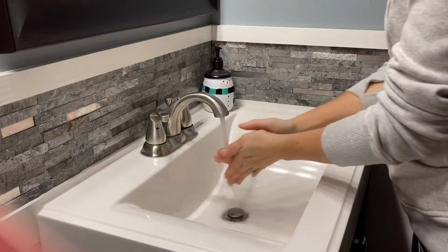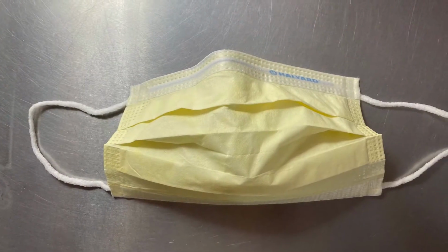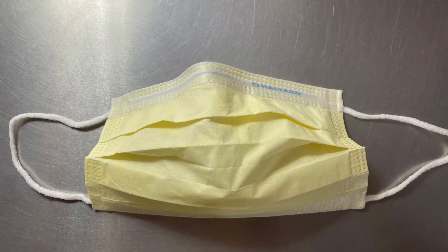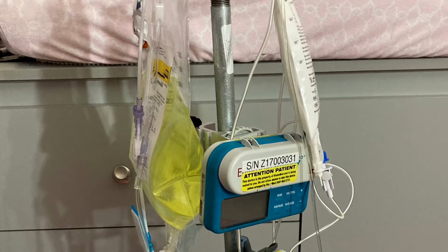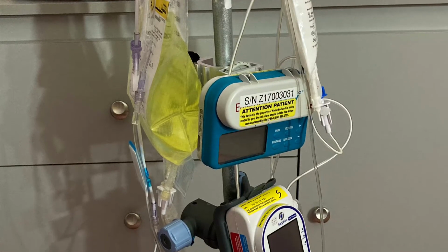As always, start with washing or sanitizing your hands. We weren't trained to use a mask while doing this, but you can if it makes you feel more comfortable. I went through a time where I always did, and now I do it intermittently. When we were unsure of ourselves at the beginning, it took us about 45 minutes to mix everything. Now it only takes me about 12.